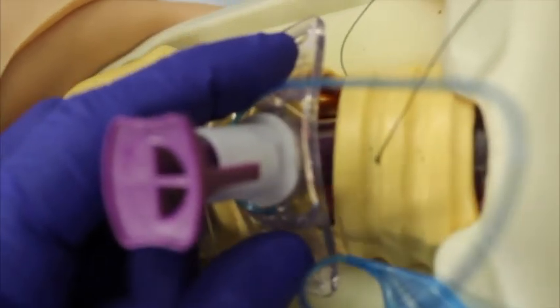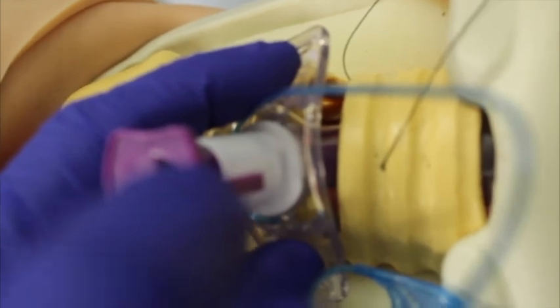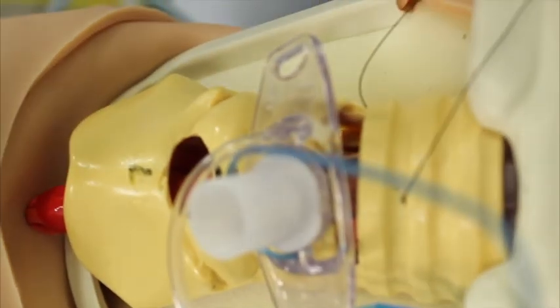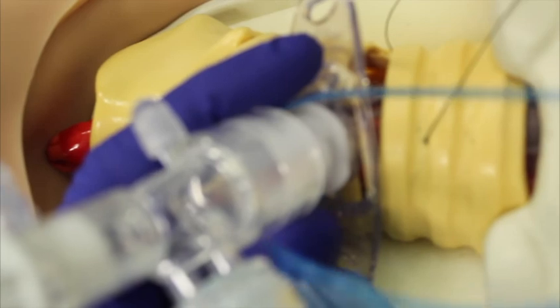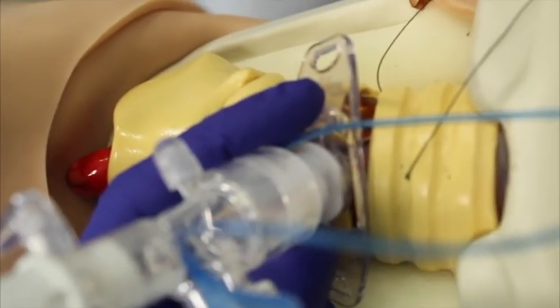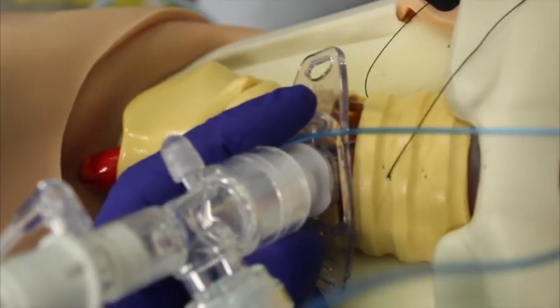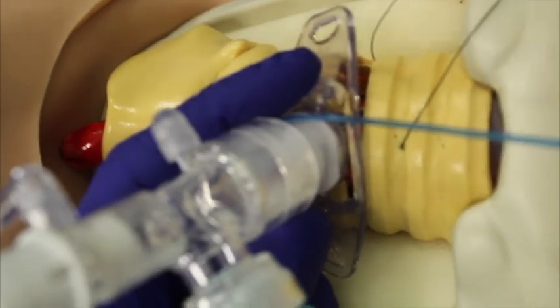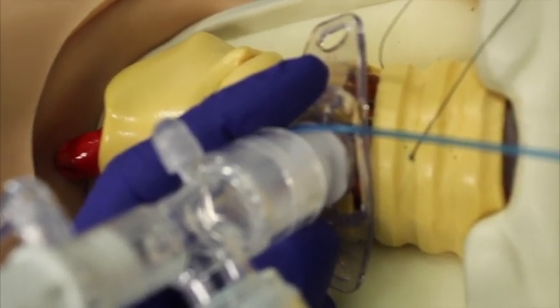The tube exchange has been achieved, the introducer is removed, but critically, ventilation is not recommenced until the cuff has been inflated, a formal seal confirmed, and the ventilator can then be reattached through the appropriate filters to ensure that a complete seal is present prior to positive pressure ventilation.